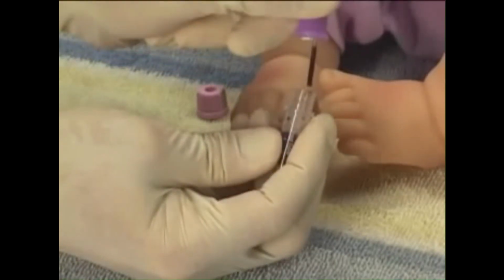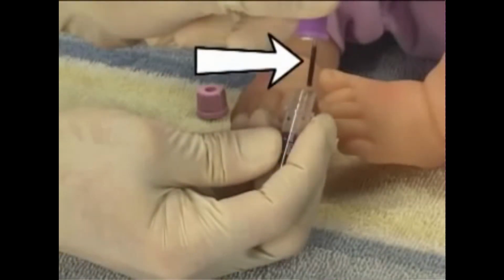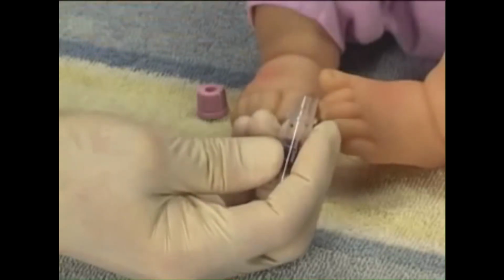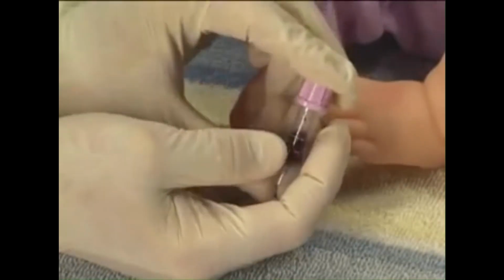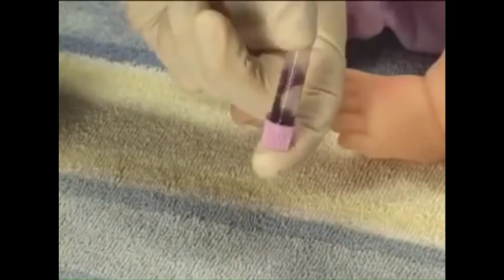After collection, remove the quick draw adapter from the microtainer and discard into a biohazard waste container. There will always be a small amount of sample in the capillary straw. Disregard this, as it is a very small amount that is difficult to remove. Cap the collection vial with its original cap, mix well, and process according to your facility's standard procedure.